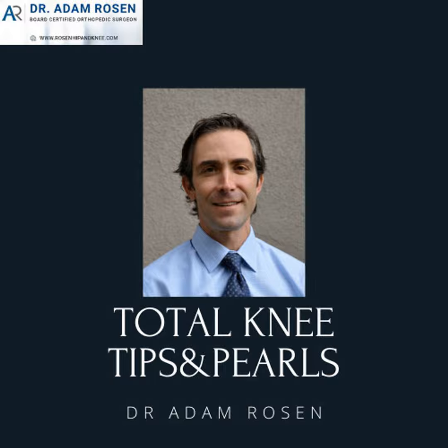It's where you will typically pull bone off if you're not careful. You have to be very cautious of the collateral ligaments and make sure you have enough flexibility, and you may need to manipulate the knee or your retractor to get back there. Before you go onto the lateral side, the question is, do I have a cruciate retaining knee or a posterior stabilized knee? Is the box open? Is the notch open?